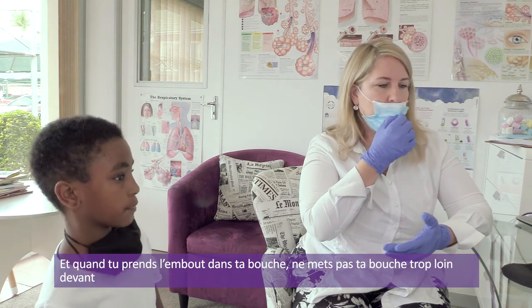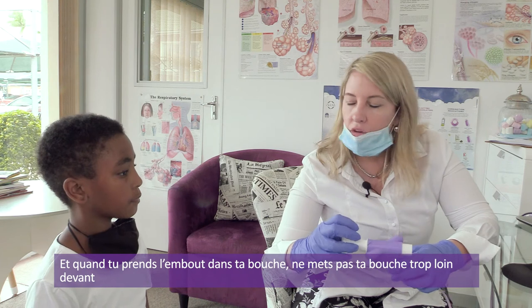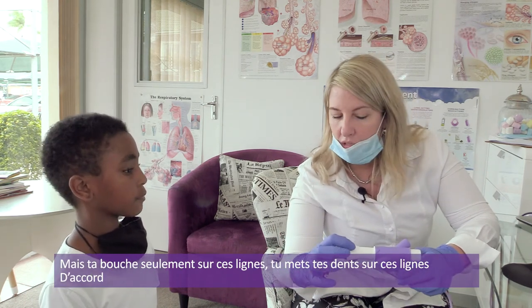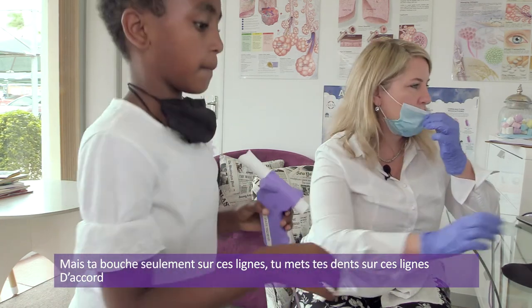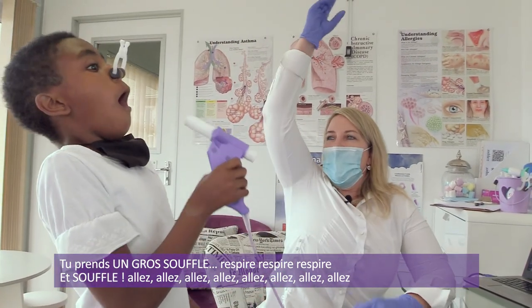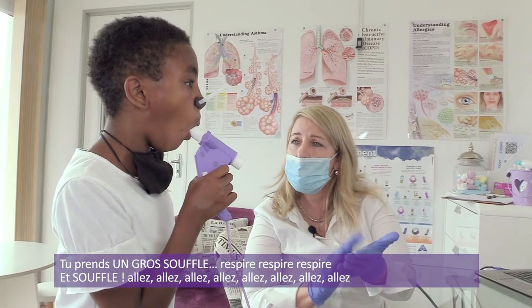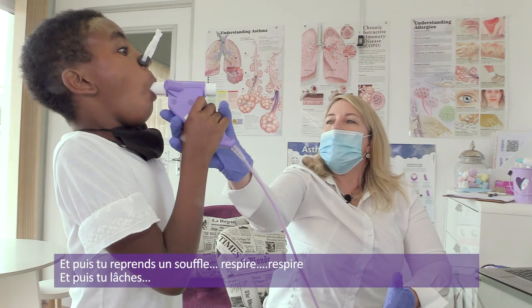All right. Okay, and when you put your mouth on, don't put your mouth so far. Put your mouth only between those lines. Bite your teeth on those lines of the mouthpiece. Okay, are you feeling all right? Okay, your biggest one. And breathe in. And take it out your mouth.